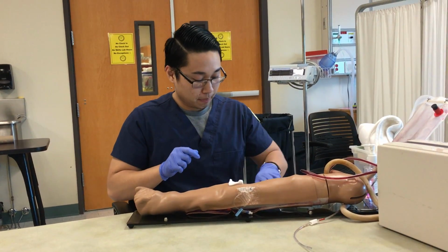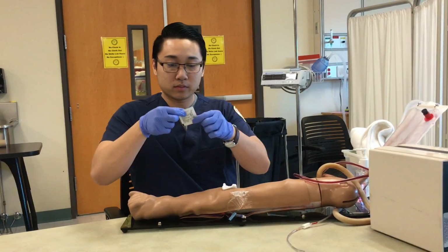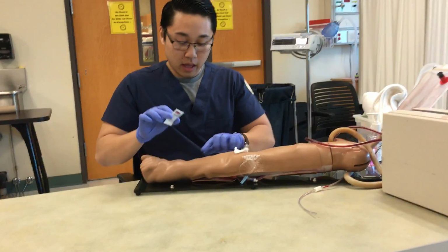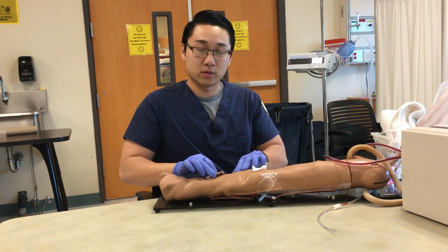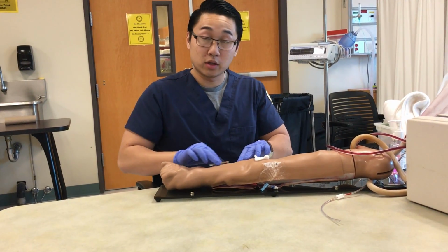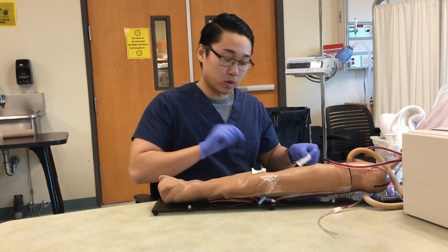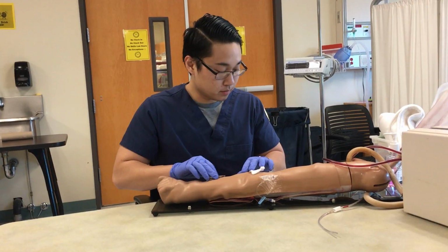Alright. So now I'm going to take an iodine pad and start from the point of where I'm going to stick the patient and circularly rotate the cleaning site 2 inches away from the middle. Now I'm going to take an alcohol prep pad and do the same.